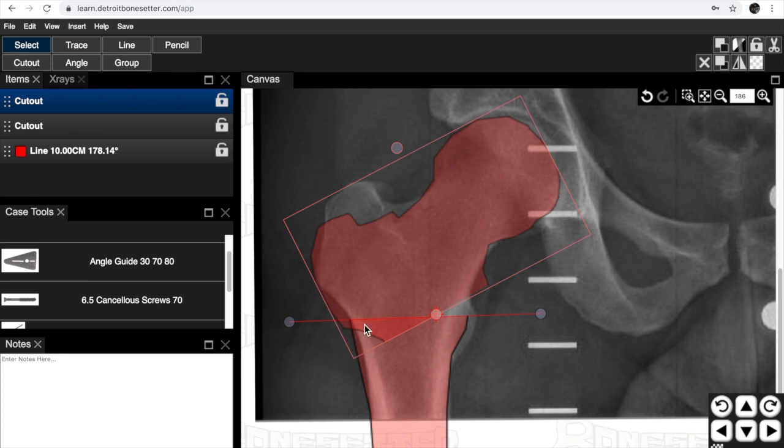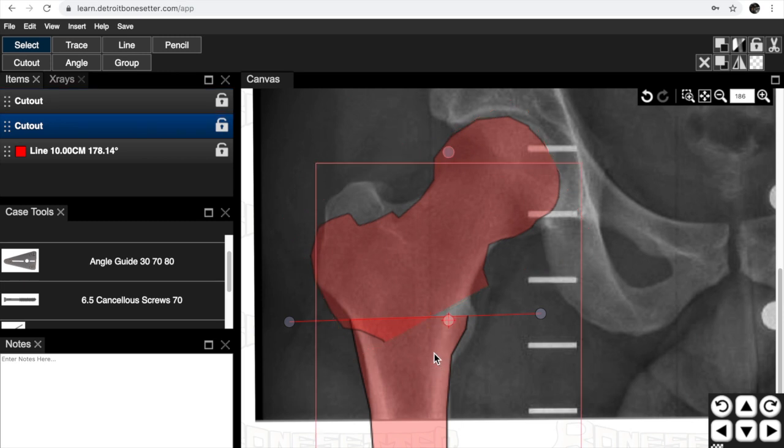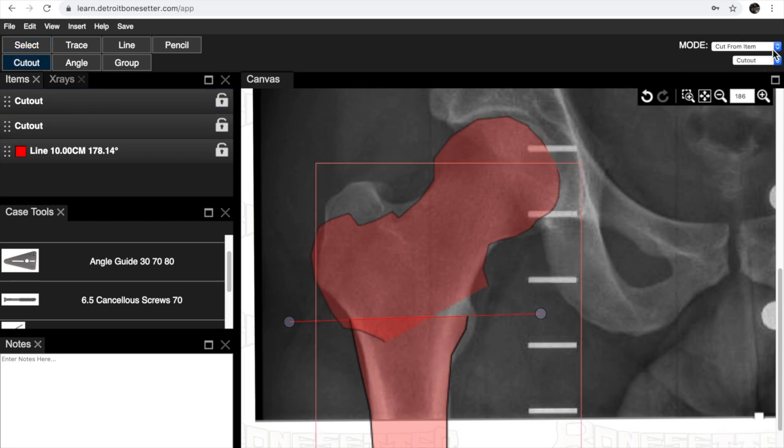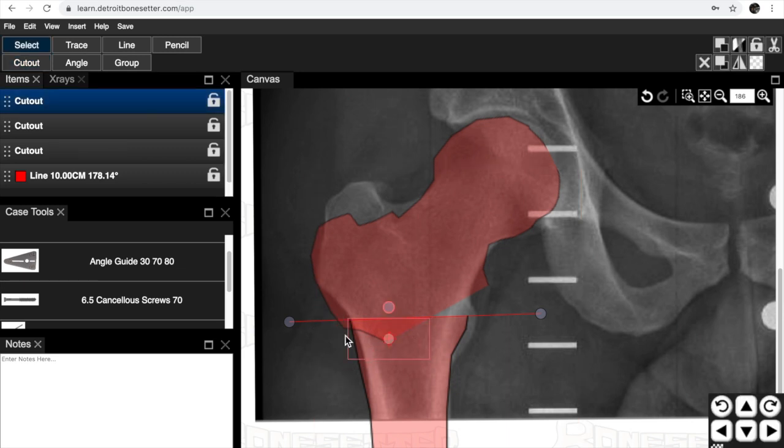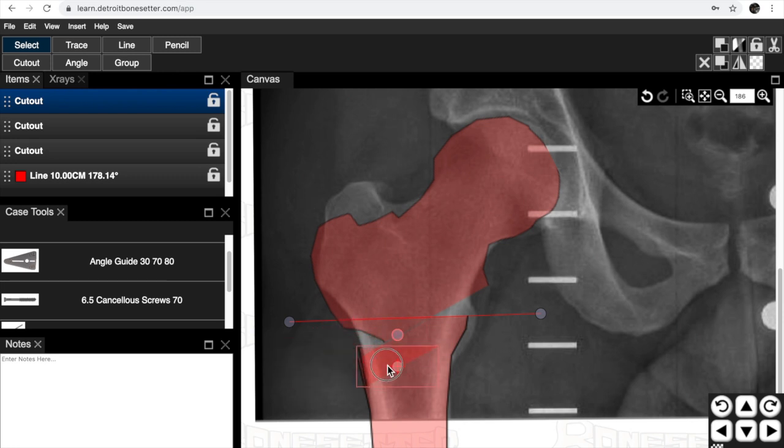We can actually cut out the piece of the osteotomy. Pick the bottom part here and come up and take the scissors. And we can actually cut out this piece here. Now we can remove the wedge. This wedge will have a measurement that you can measure the sides.